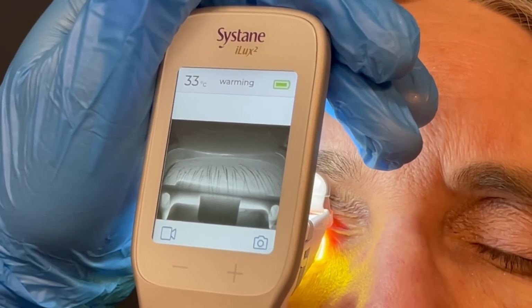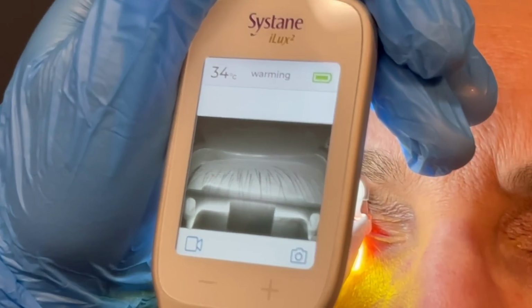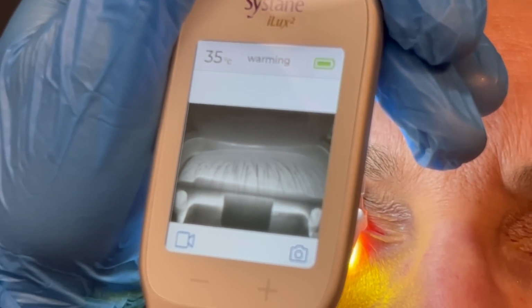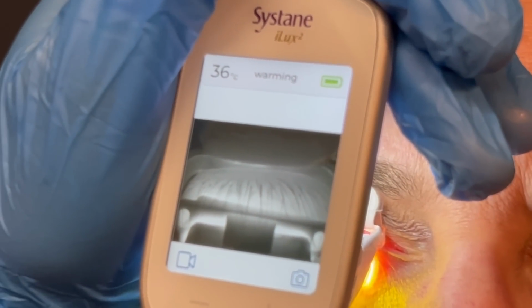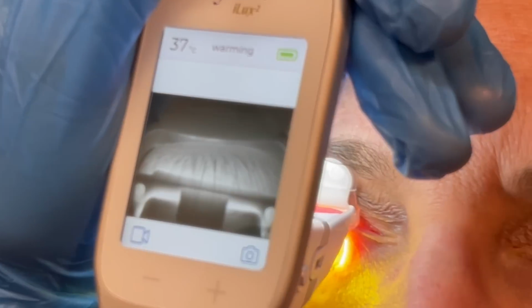So if you want to watch on the little display as she relaxes and her eyes have a little bit of a spa treatment, this device is heating up. We're currently at 36 degrees Celsius. Do you feel it warming up, Heather? Okay, very good.